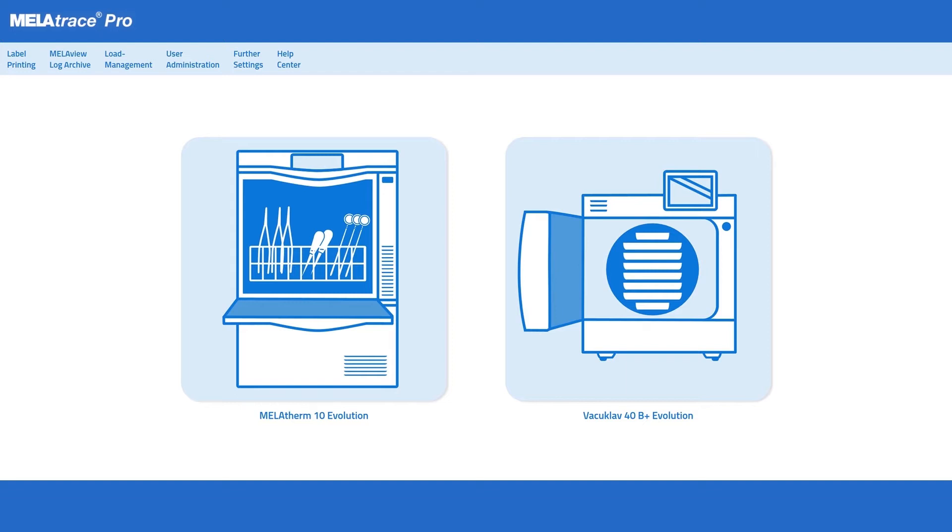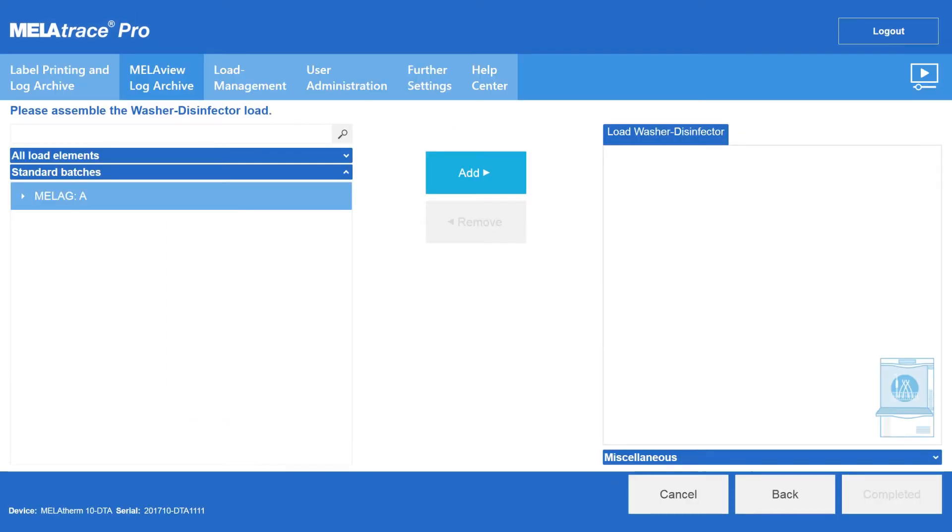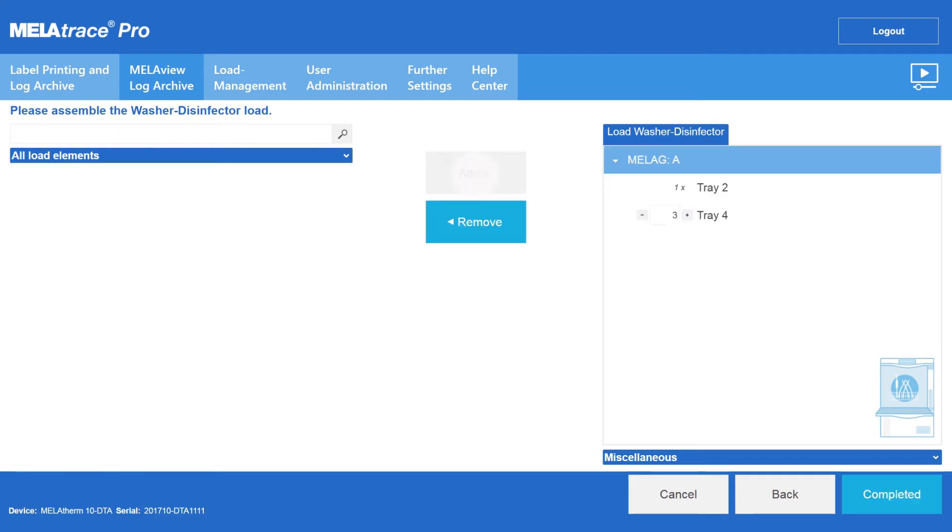To start the documentation process of instrument decontamination, please click on load washer disinfector. You can add a defined load configuration to the washer disinfector with just a single click.